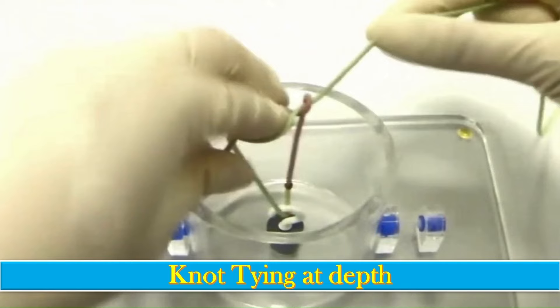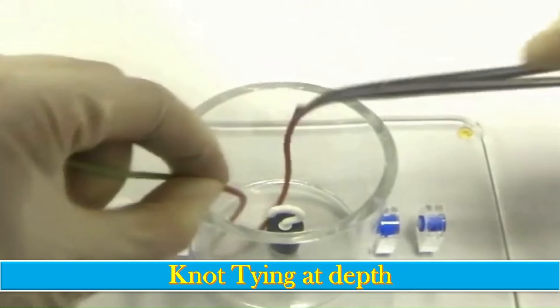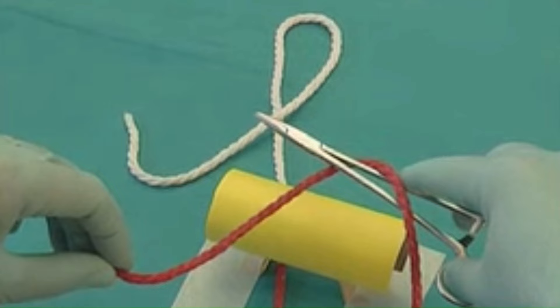Next comes tying in depth. First, hook the thread around the structure to be tied. Take the pink end of the thread and bring it over the index finger. The index finger flexes to bring the green thread around, then extends to take the green end inside the loop. The knot is then tightened.